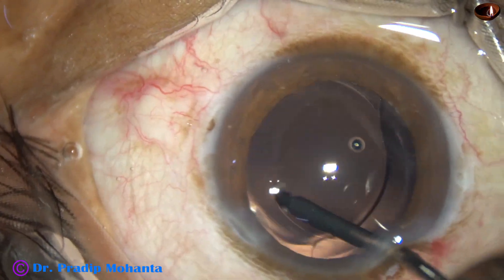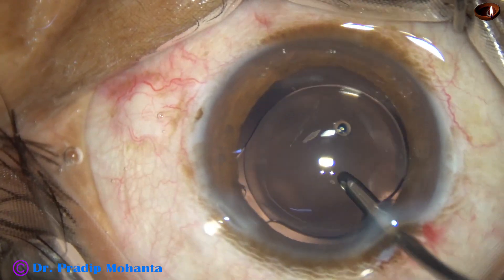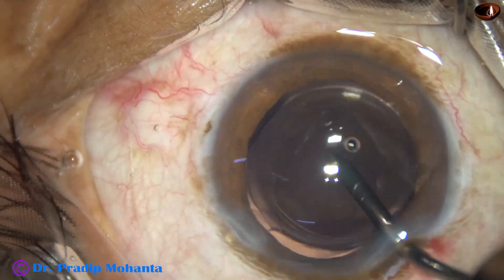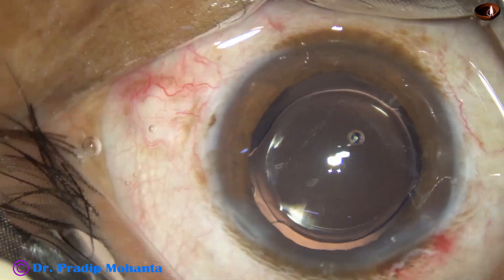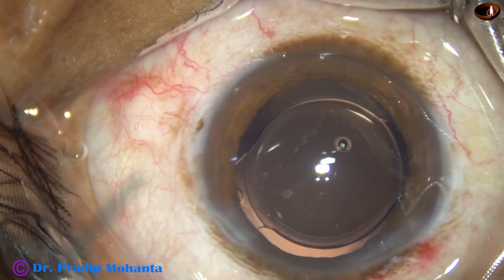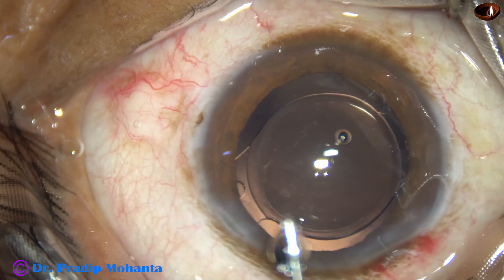The lens is dialed. You can see that the optic is overlapped all around by the rhexis. This is an optimum-sized rhexis of about 5.25 millimeters.